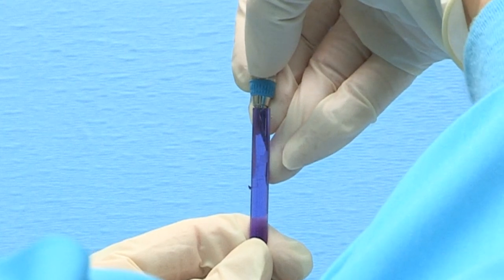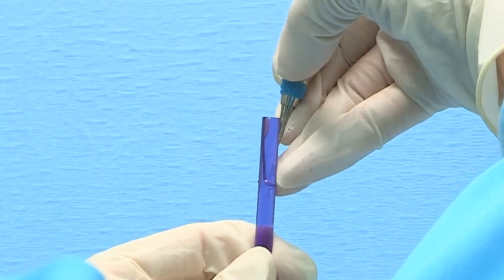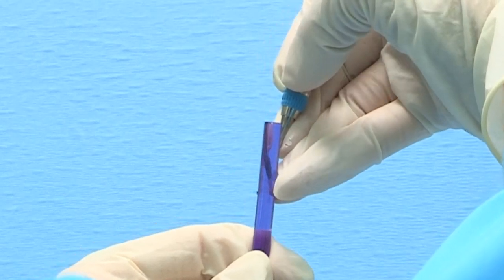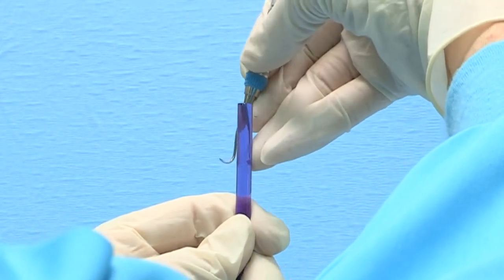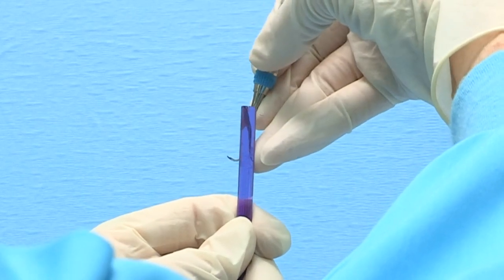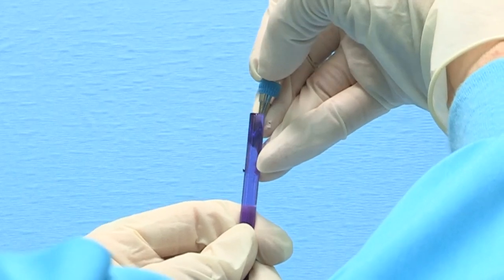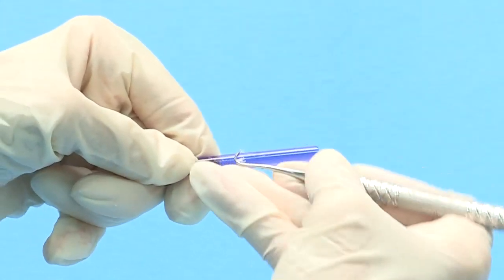Tilt the terminal shank very slightly toward the test stick, using the same angle you would use for scaling. Place the cutting edge laterally into the test stick and release. Test the entire length of the blade at the heel, middle, and tip. If the instrument is sharp, it will bite or grab the plastic test stick. You will also hear a metallic click or ping upon quick release. It is important not to shave the test stick, as this will dull the blade.